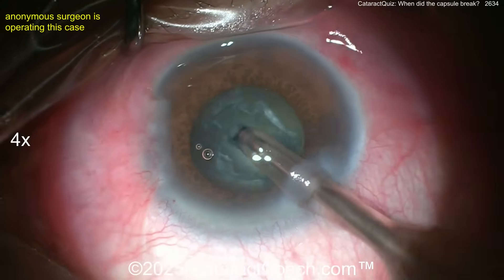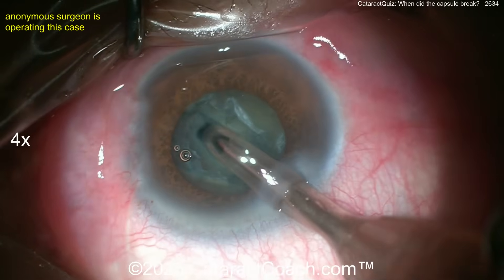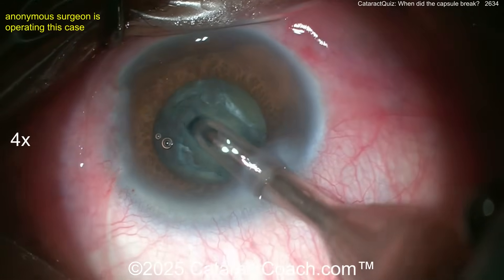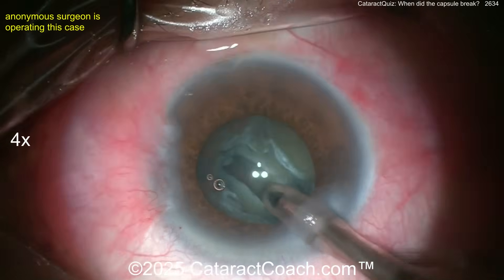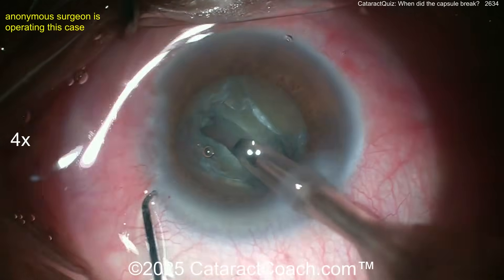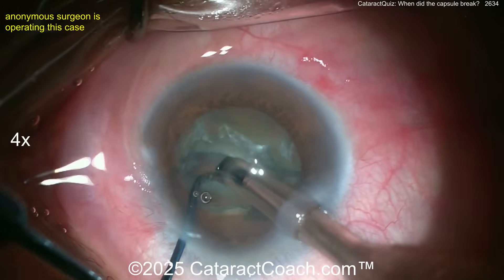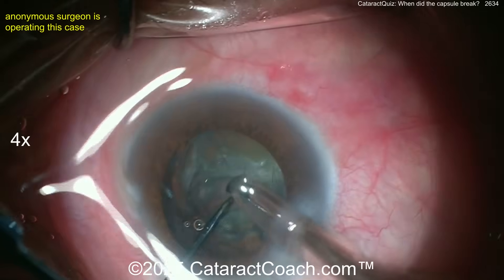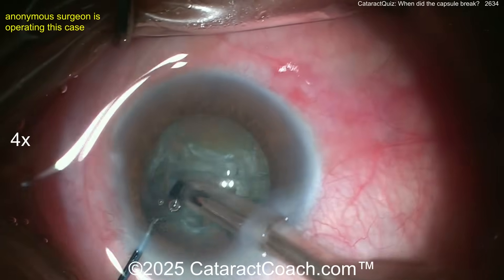Maybe using a little bit of higher phaco power here would be helpful to get that going. Here's a groove down the middle — let's continue the groove. So far so good. Maybe use more phaco power because it's a little denser than expected, or expose more of the needle tip. Here's a crack down the middle.